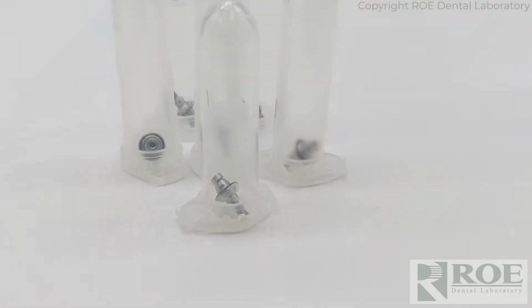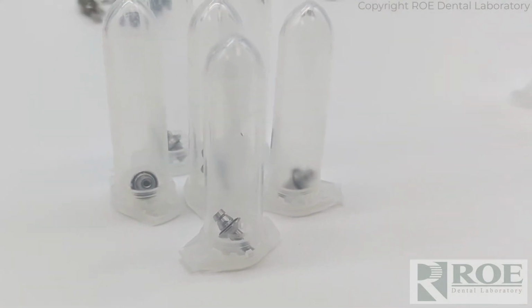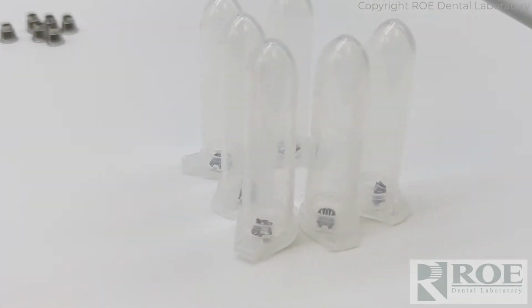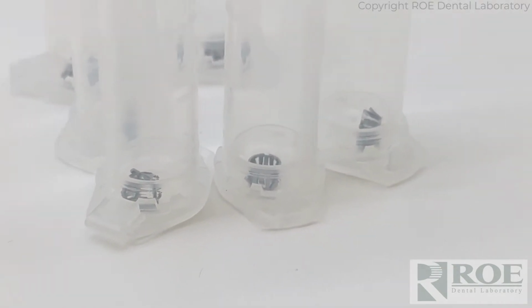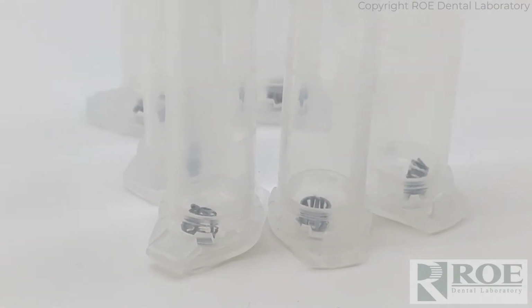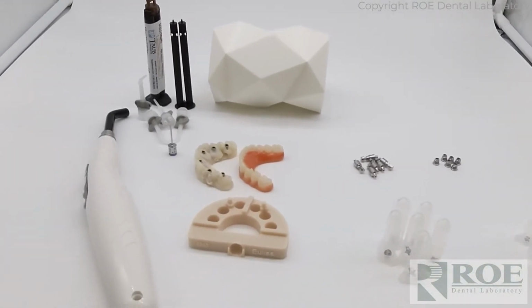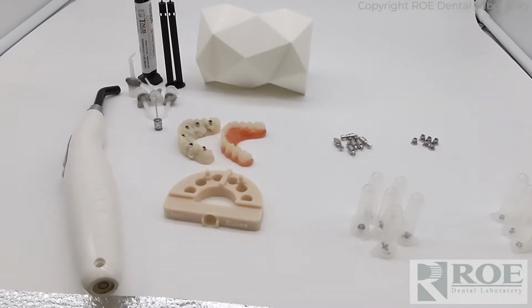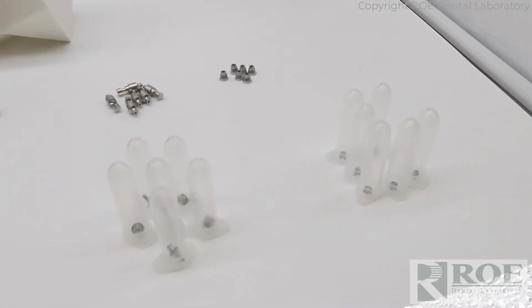We will need abutments. In this case, all 6 implants are straight, so these are Smileloc roto abutments. And then you'll need a Smilekey, a Smileloc for each one of the sites. So those are the items needed to convert back in the laboratory, the office laboratory, after you picked up the RAPID appliance.